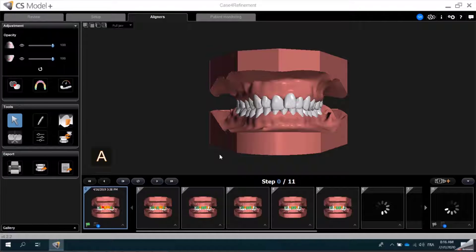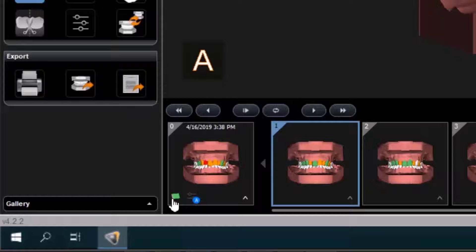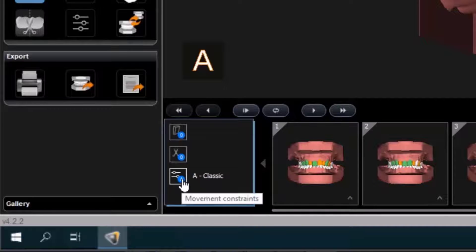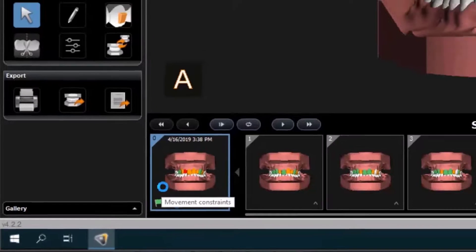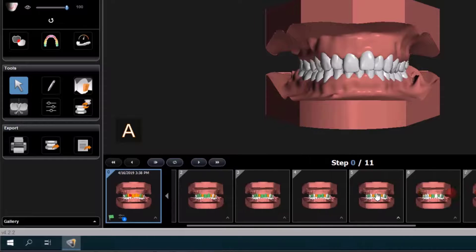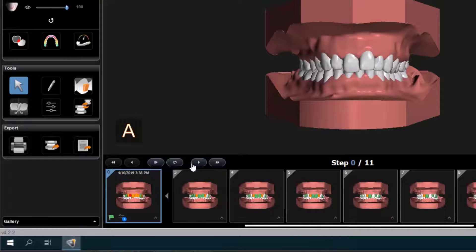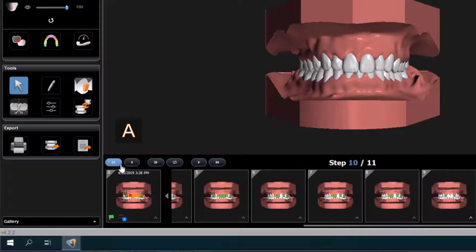Each of the steps are displayed in a gallery below the model. The first step is indicated by a green flag and includes today's date. The blue letter A indicates that I have chosen the classic setup. I can click the up arrow, select the classic movement constraint, and view a summary of the movements required for this treatment. I can navigate through each of the steps by either clicking on them, using the slider bar, or by using the navigation buttons.